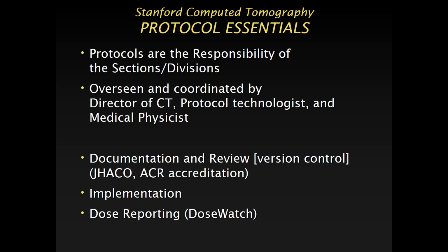And then another not so easy thing is to implement this. If you have a new scanner or you change a scanner, if you change a protocol, to implement it across all scanners is very difficult. So just imagine if somebody decides, as you would think it's very easy, well, why don't we just do coronals on all renal CTs? This means first we have to decide how to really do it, but then you have to implement it on all scanners. Every scanner where a renal protocol is included has to have this additional series, so keep in mind that these changes are not that easy.